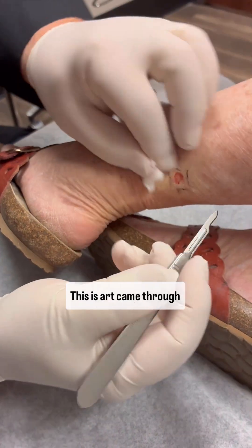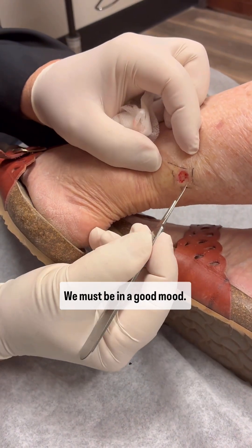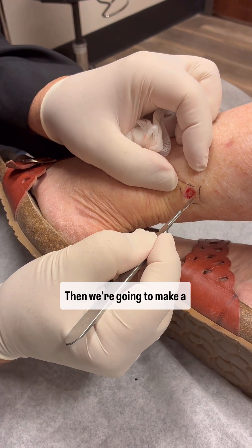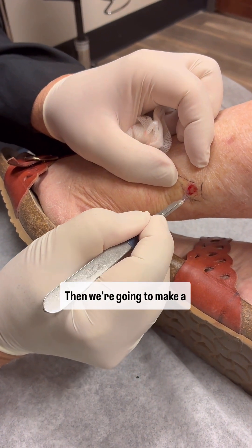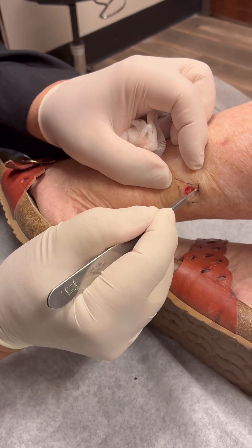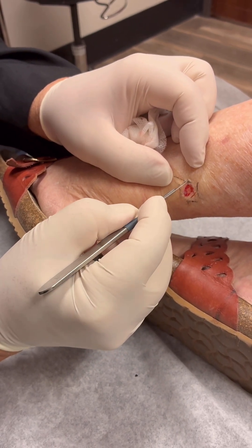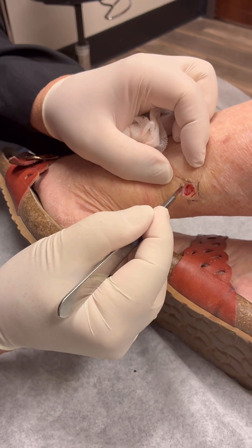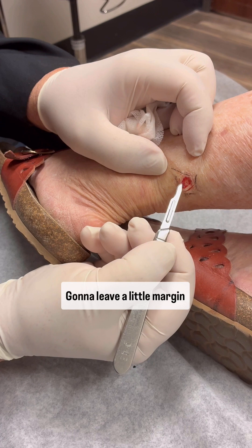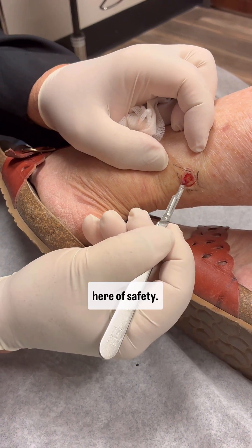This is quite pain-free today. You must be in a good mood. Then we're going to make a cut around it. Got to leave a little margin here of safety.